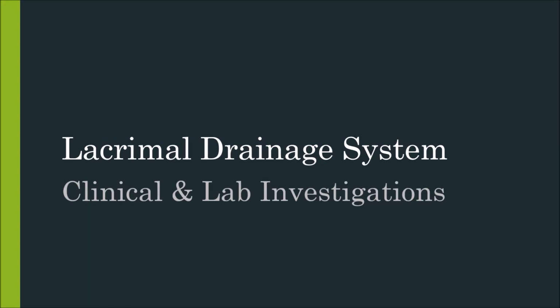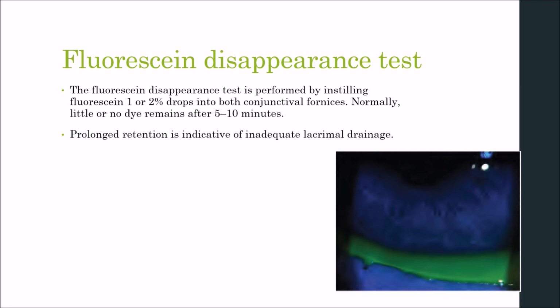Our third lecture is clinical and lab investigations. In cases of pathology in lacrimal drainage system, we will start with fluorescein disappearance test.